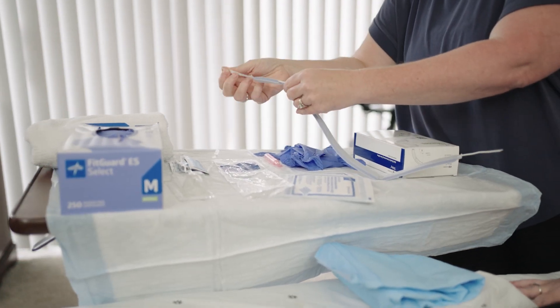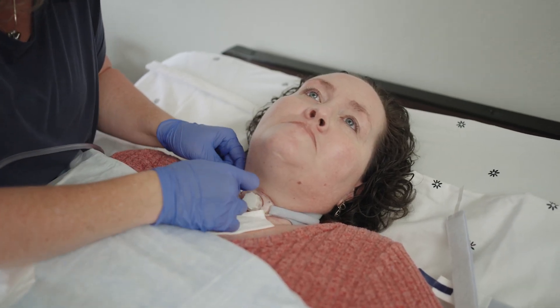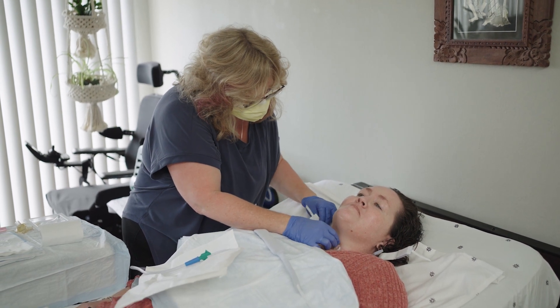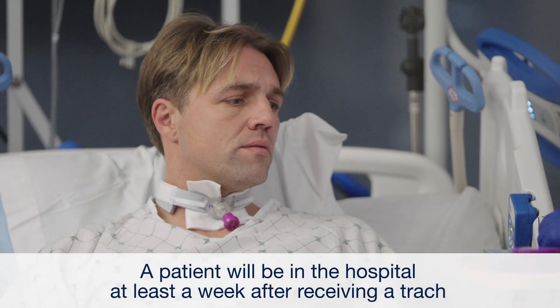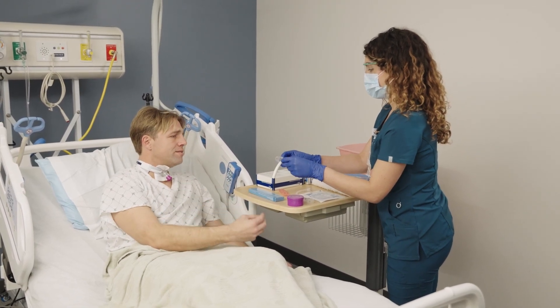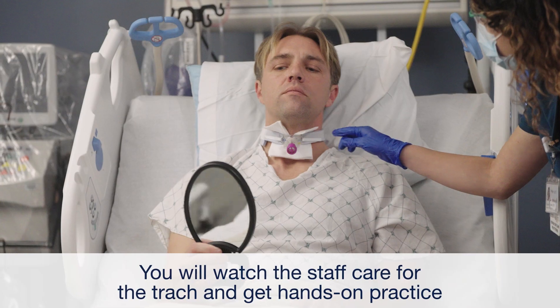Now we will talk about the basics of caring for a tracheostomy. For many patients, the trach is their only airway. Great care must be taken to make sure the tube remains clear, clean, and does not fall out. For this reason, caring for a trach will require training for you and any caretakers before leaving the hospital. At a minimum, a patient will be in the hospital a week after receiving a trach. During this time, the care team will provide you with education so you are prepared for long-term trach care. Your training will begin immediately as you watch the staff care for the trach and give you and your caretakers hands-on practice.